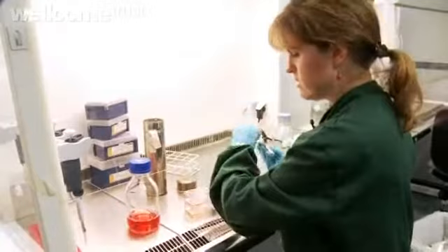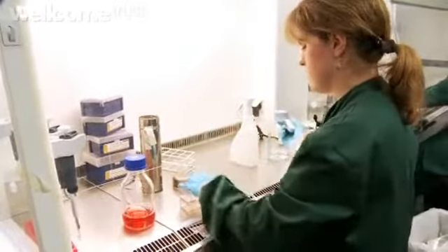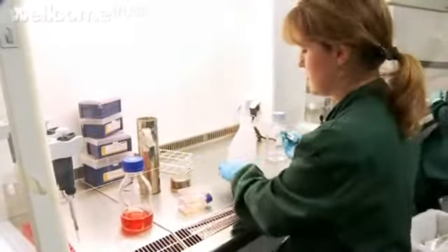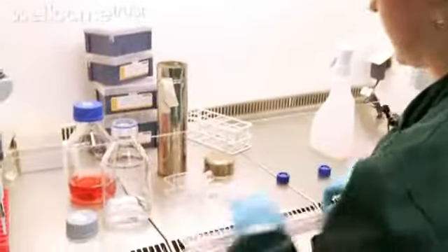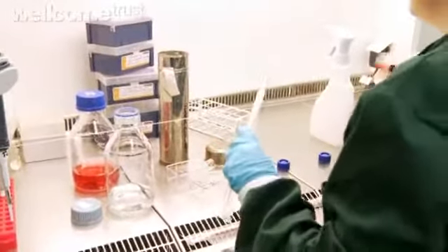So when you're feeding your cells, the first thing you want to do is take off the old media, the old food that they've used all the nutrients from. So we use a vacuum pump for that. And all the waste you have from the cell culture needs to go into disinfectant to kill whatever's on there, because we don't want it getting outside. Even if it's not really that dangerous, it's just good practice to kill any bugs that you're not using anymore.